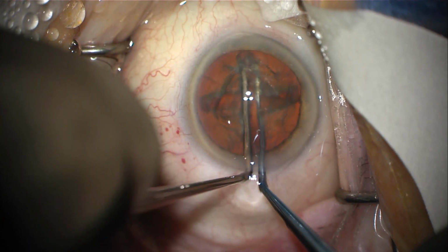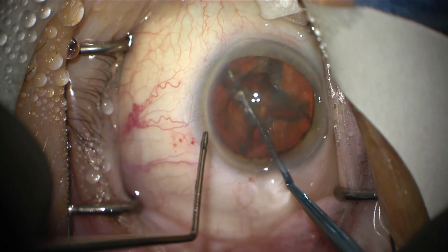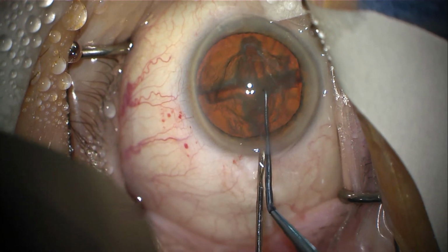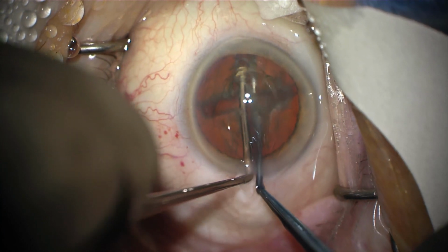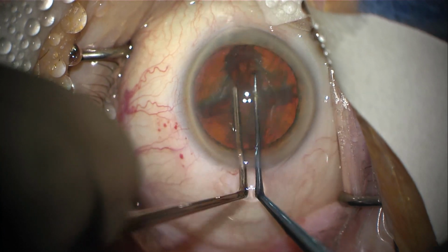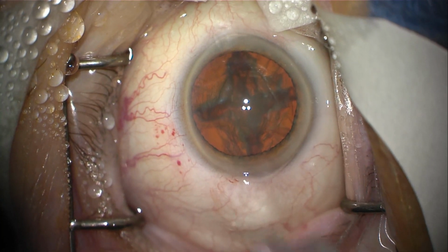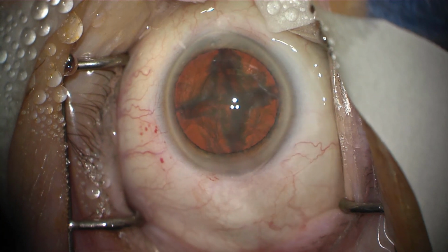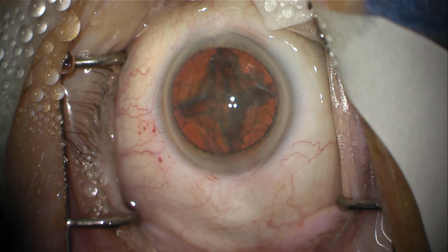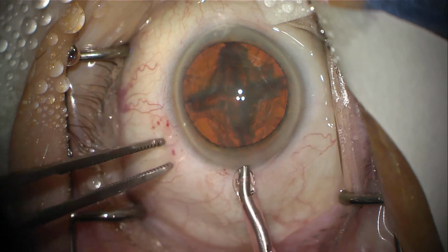I then crack the lens because I was able to make that groove about 90% thickness, so it'll crack easily for me. Now that I have 4 equal pieces, think of it as a pizza pie with 4 slices. I hope I'm not making you too hungry with the M&M and pizza pie analogy. And there were some more numbing drops over there. So now I split this cataract or the chocolate into 4 equal pieces.